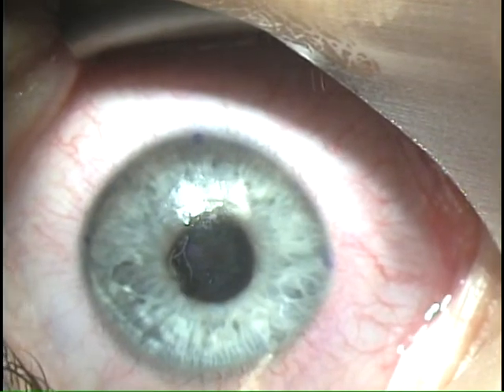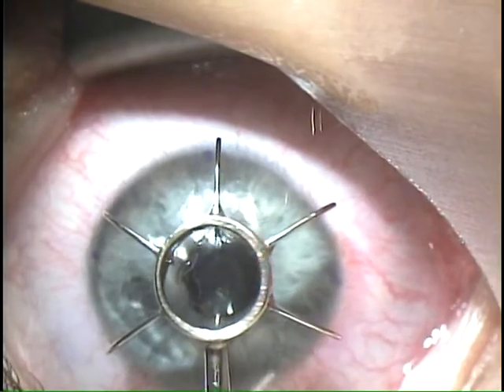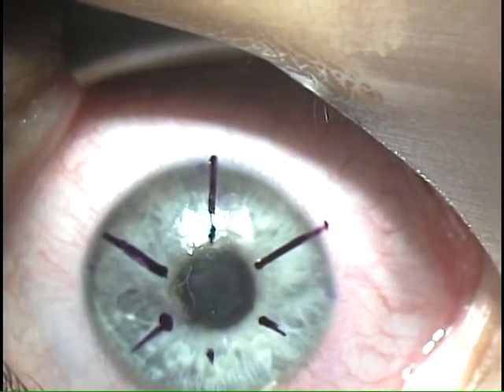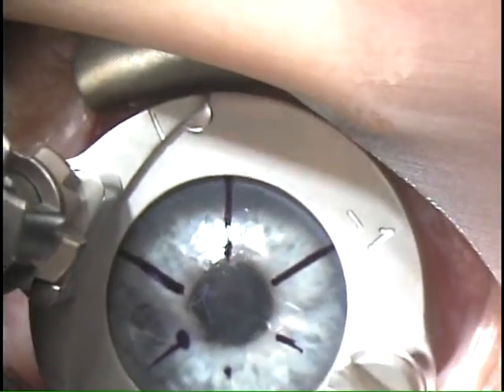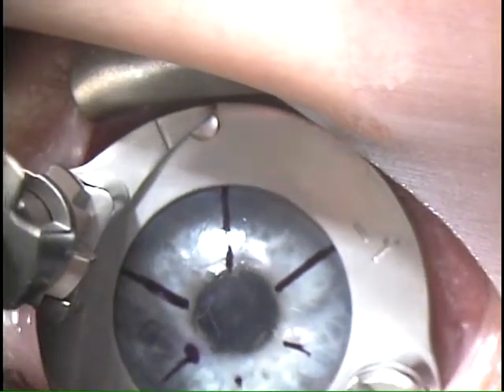We're going to begin with a mark, and then again we're going to place this template on. Straight, good, suction on.